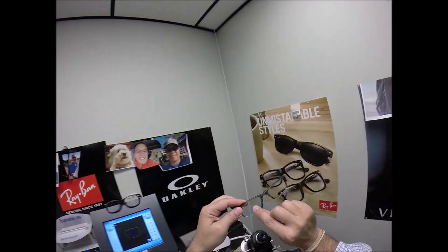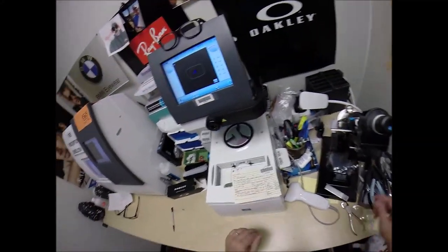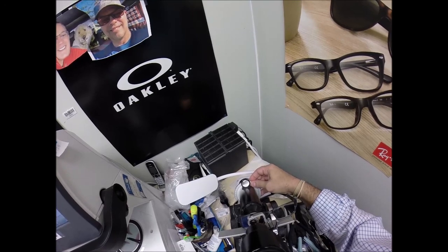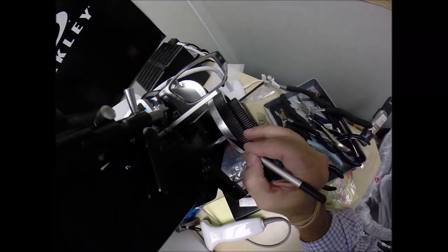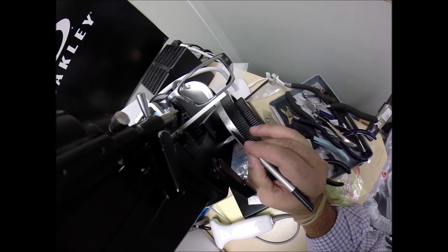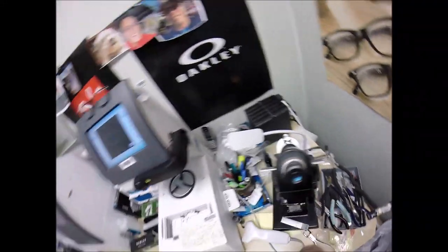So we're gonna come down here, place it just above the black dot into my Marco 101 lensometer. Read the power. Oh, just turn the axis wheel to 130. Ooh, that was scary. That didn't come into focus. 130. And I'm getting, where's my stylus? Minus a quarter. One tick mark going away from zero towards one in the red, not the black. Those are plus powers. See the plus? These are minus powers. One tick mark.